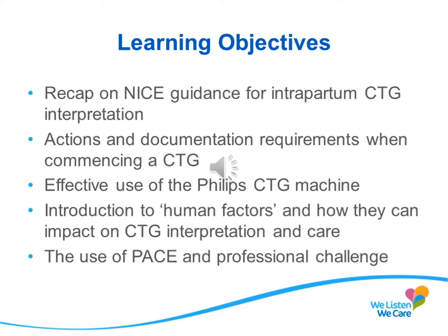The learning objectives for this session are that we'll recap on the NICE guidance for intrapartum CTG interpretation. We'll outline the actions and documentation requirements when you're commencing CTG, and we'll discuss the effective use of the Philips CTG machines which are in use at NUH. We'll also introduce the human factors and how they can impact on CTG interpretation and care, and we'll introduce the use of the PACE tool and professional challenge so that you feel empowered to ensure that any concerns about CTG are listened to and acted on appropriately.